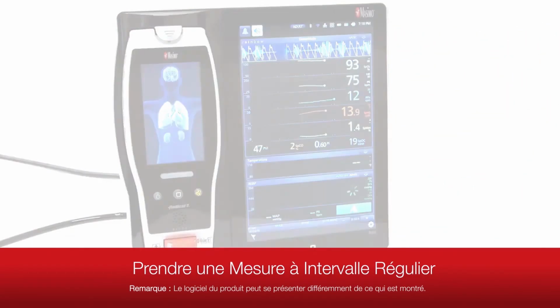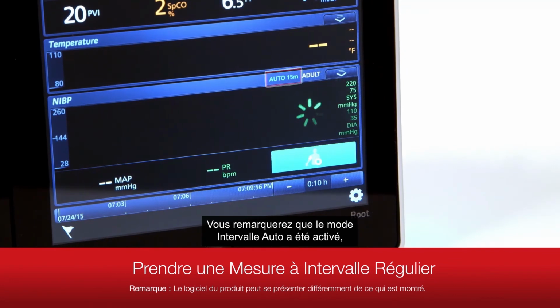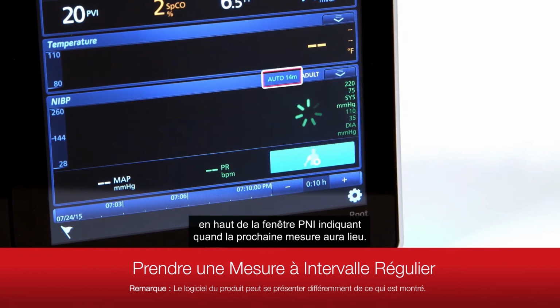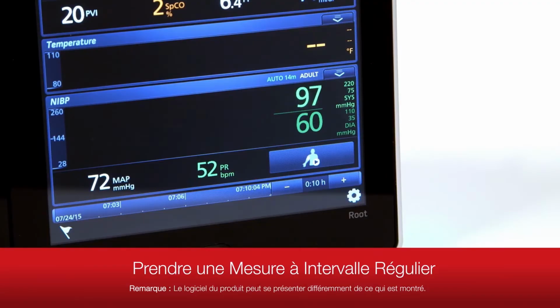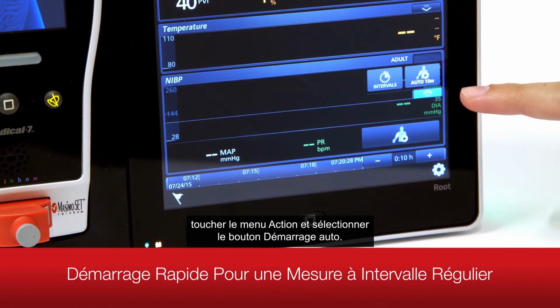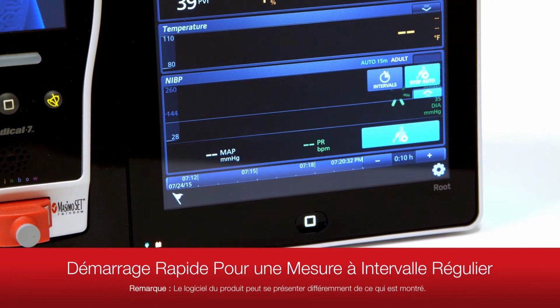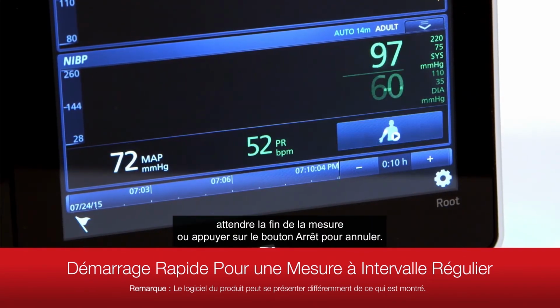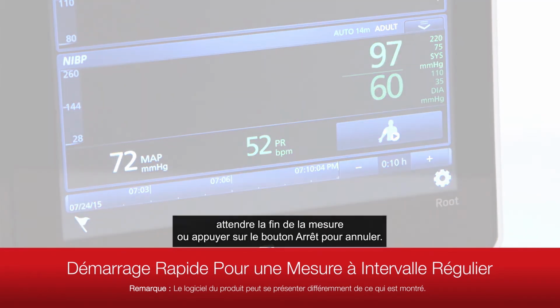To begin measurement, touch the Start Auto button, and then press the arrow or Home button to return to the main screen. You will notice when automatic interval mode has been activated, the blue countdown appears at the top of the NIBP window, indicating when the next measurement will occur. To quickly enable the automatic interval measurement using the previously defined settings, touch the Action menu and select the Interval Quick Start button. Measurements will immediately commence. Wait for the measurement to complete or touch the Stop button to abort.